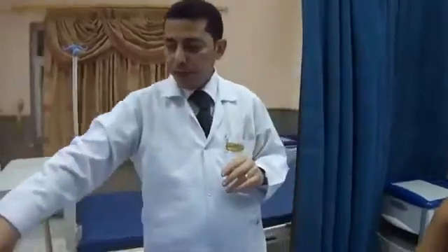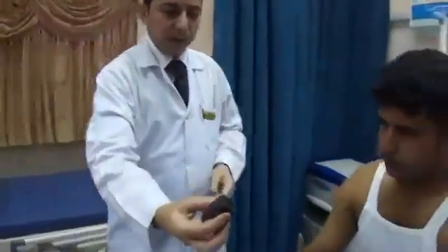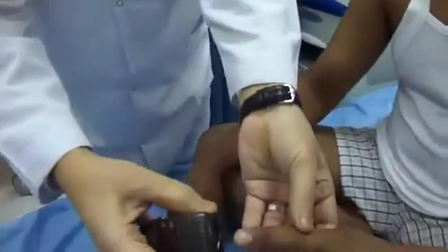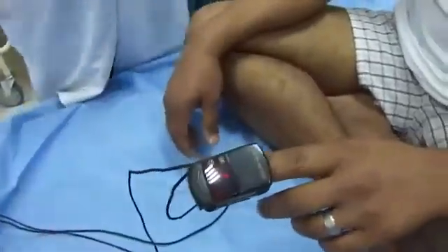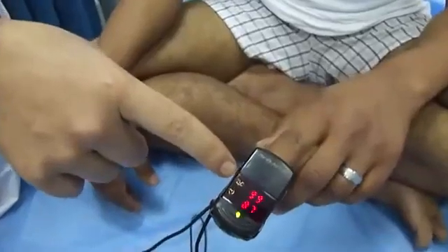Relative bradycardia has many causes, for example typhoid, brucellosis, drugs, and so on. Lastly, we have to check the pulse oximetry using a pulse oximeter. I will check the patient's left index finger. You have to choose two or more areas to check, and we will see here the saturation of oxygen.